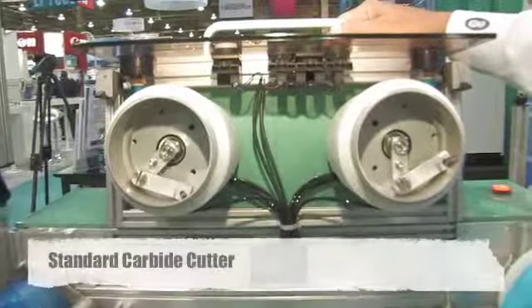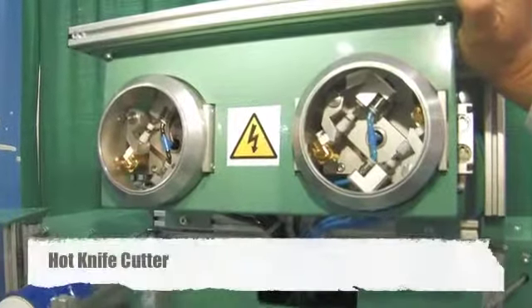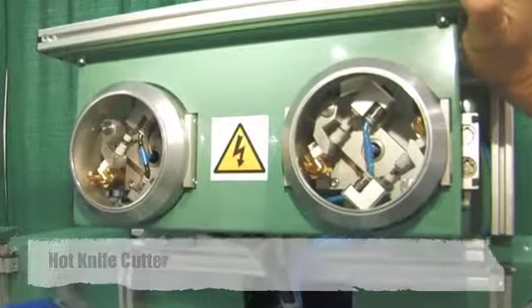Another option is the cutter blades. You have your standard carbide cutters or the hot knife cutters. The hot knife cutter provides a cleaner cut with less debris, and it accommodates for the polycarbonate gate on the lenses.